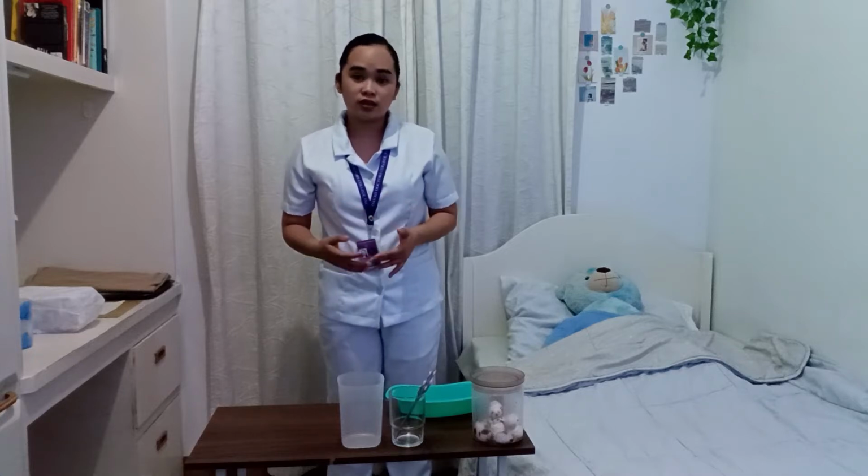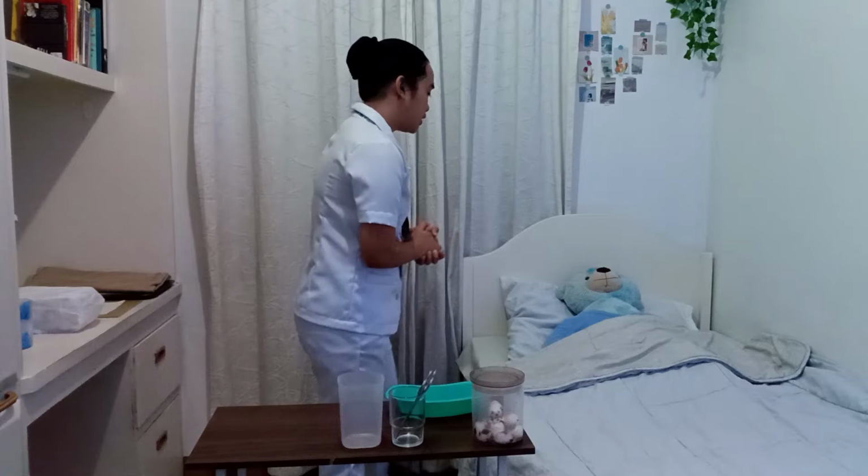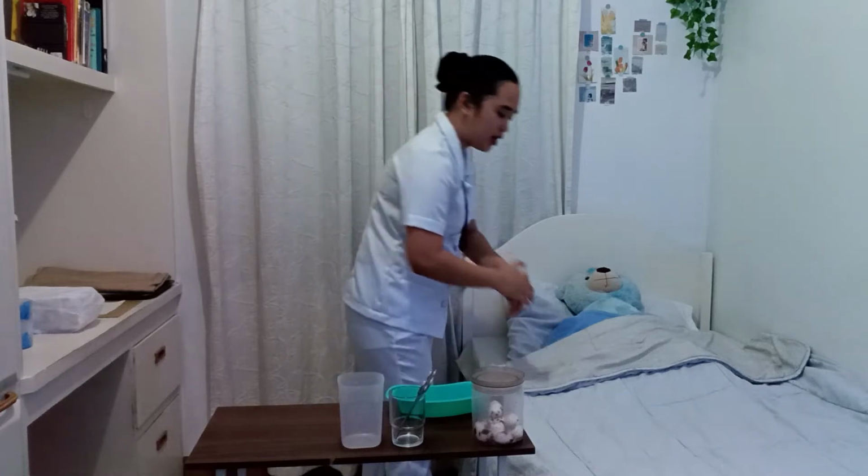So now position the patient in a dorsal recumbent with her knees flexed. So this will provide a good visualization of the meatus, where we will be introducing the catheter. And also the gravity will aid the flow of urine when the bladder is higher than the end of the catheter. So now ma'am, I need you to flex your knees and I'm going to help you with that, okay?